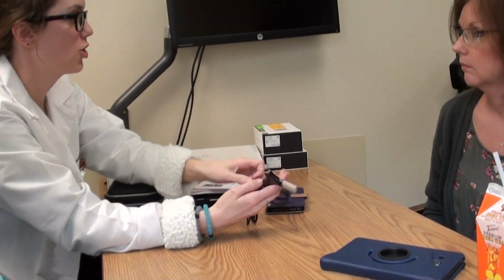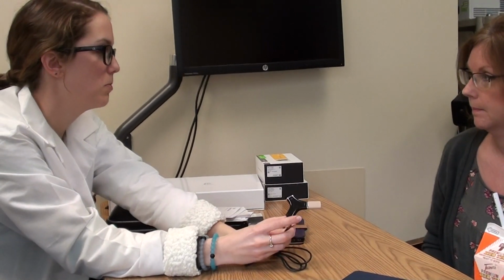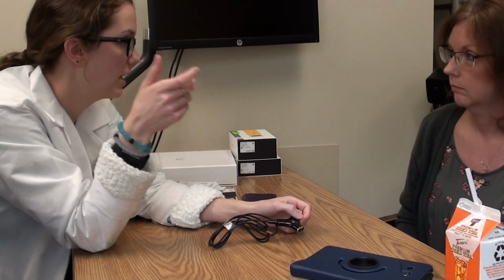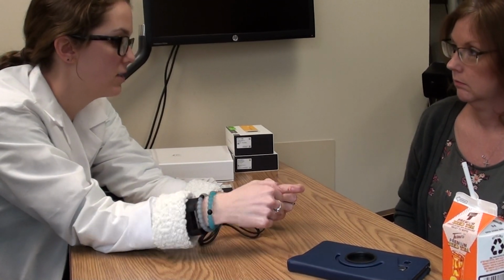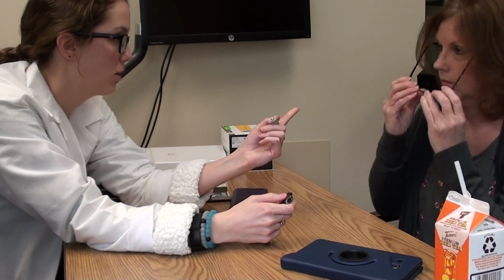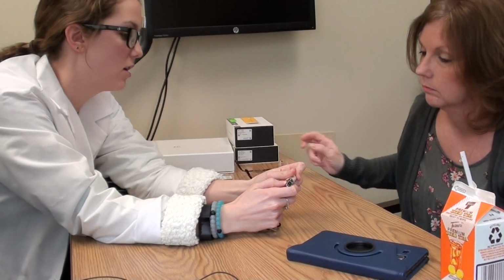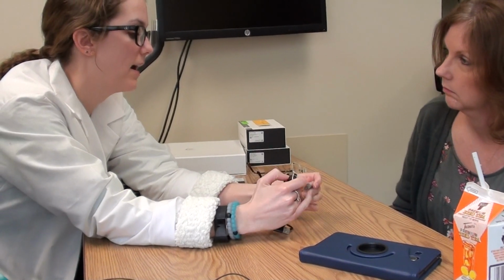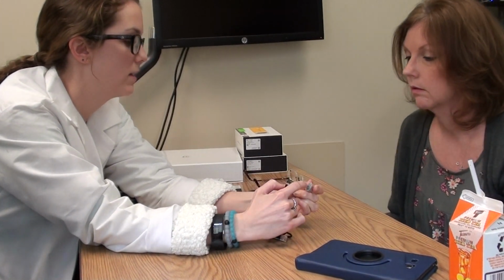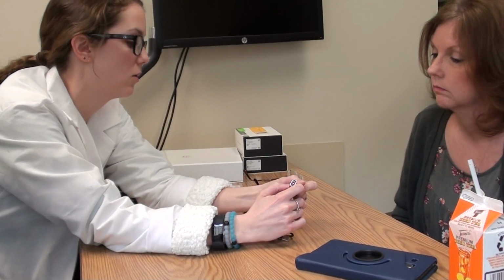So this is your charger. Okay. So this will plug into the wall, I'll show you that. And then this is how you charge your batteries. Okay. So when you take it off at night, you're gonna put the batteries on here. And they go on here the same way that you put it on there. Same thing. It goes on twisted. You wanna line that notch up with this hole. See that hole? Okay. They go together.